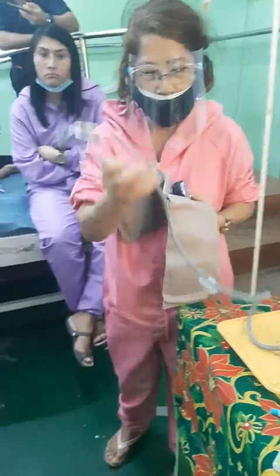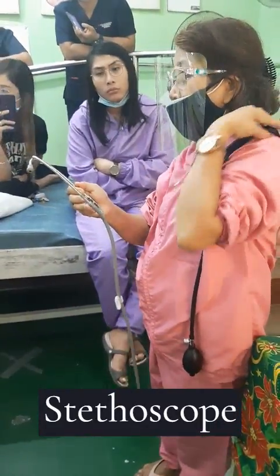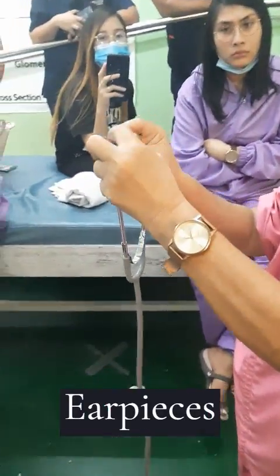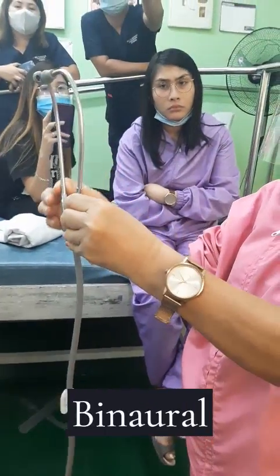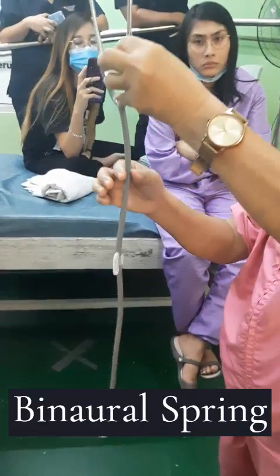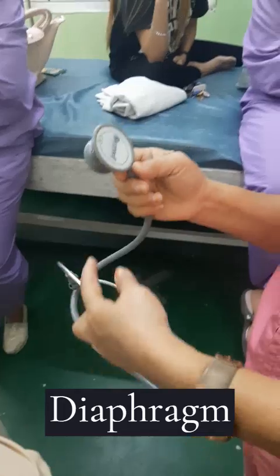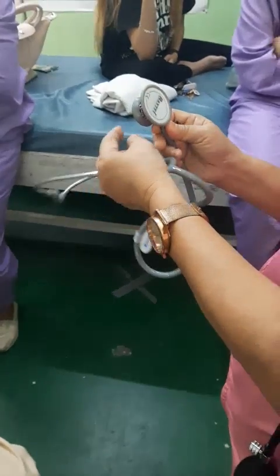This is your stethoscope. Your stethoscope is for auscultation — you cannot do auscultation without a stethoscope. This is the earpiece. This is the binaural and binaural spring. And this is the stethoscope rubber tube. This is the diaphragm and this is the bell.